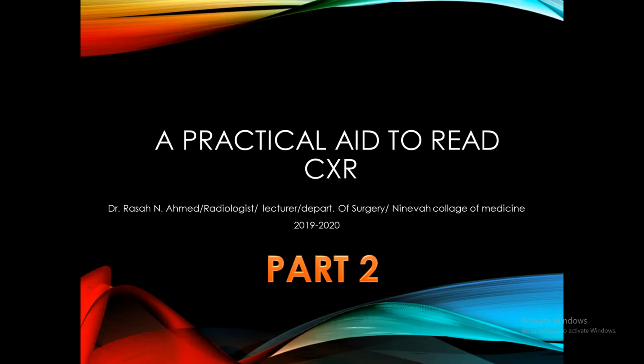Practical aid to read chest X-ray presented by me, Dr. Rasha Nadeem Ahmed, lecturer at Department of Surgery, Nineveh College of Medicine, and this is part 2 of this.